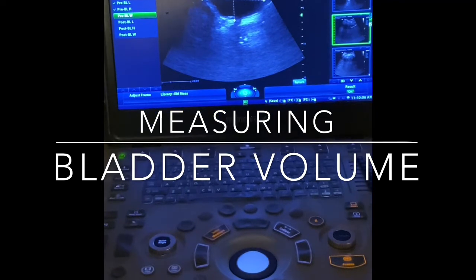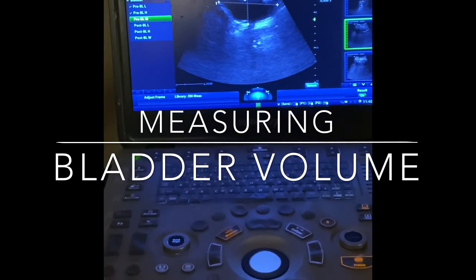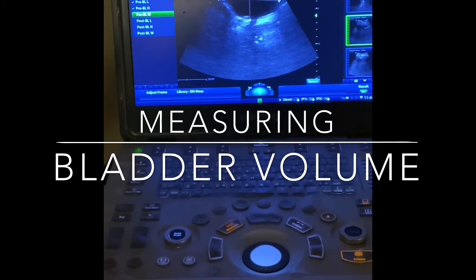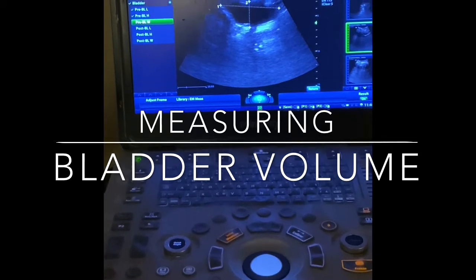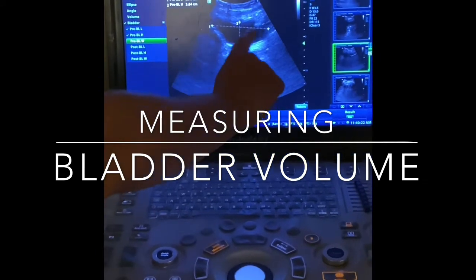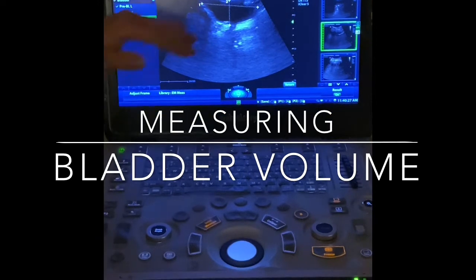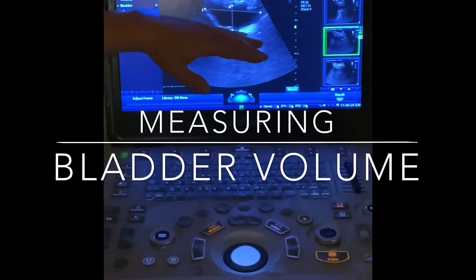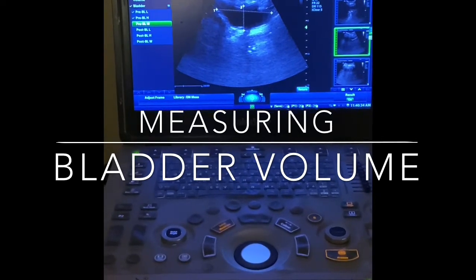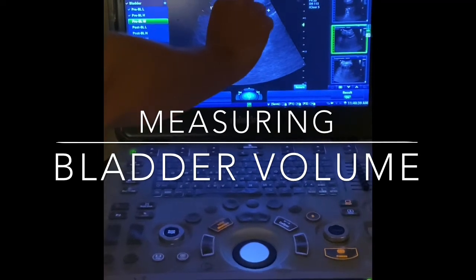Looking at the screen, if you could picture the transducer on the patient's body, the indicator is oriented towards the patient's right side. So the probe is oriented left to right on the patient. That means that this measurement is the patient left to right. This top-down measurement is what's closest to the probe to what's furthest from the probe. This means it's measuring from the patient's stomach to the patient's back. So this is the width of the bladder, and this is the depth.